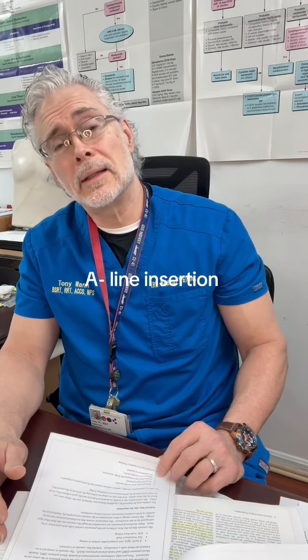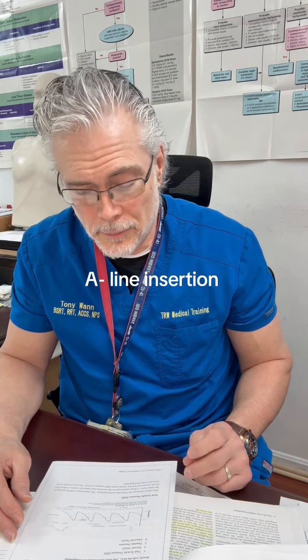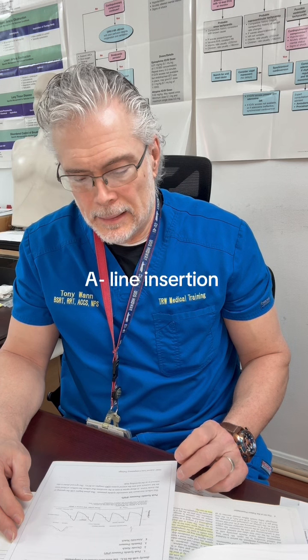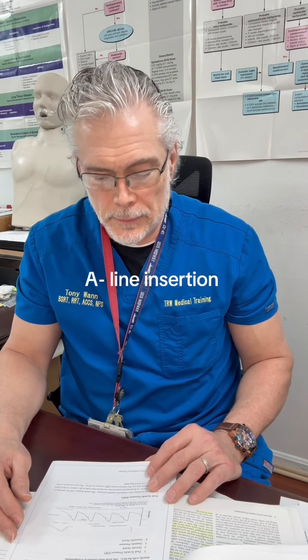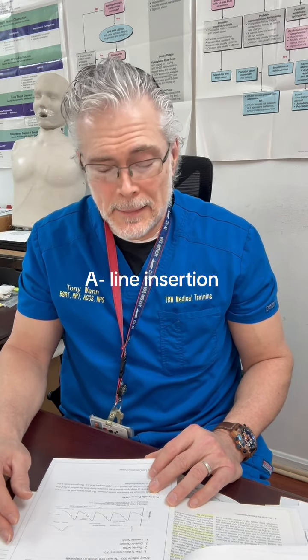Complications and troubleshooting the A-line. I have to do that all the time at work. Sometimes it can be a very simple thing. But we'll talk about the MAPs and how to calculate some different formulas, which are very interesting, which I'm not going to get into now.